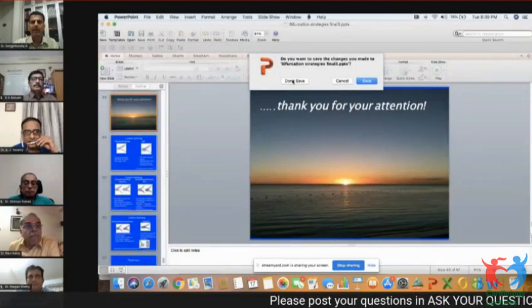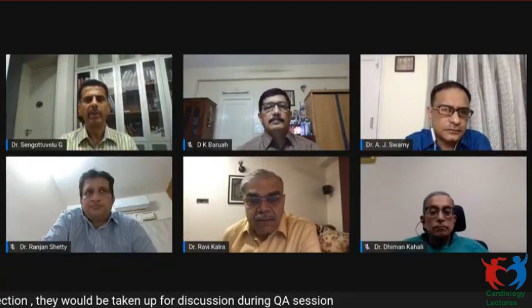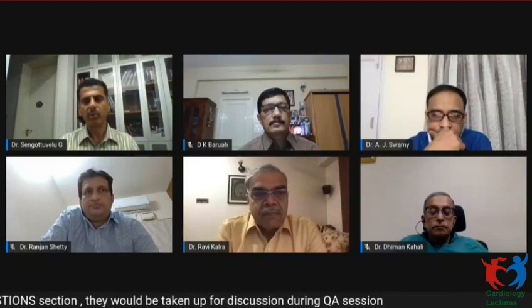Fantastic. I think the important point for any beginner is to assess the anatomy very carefully and at least know the three simple techniques: the provisional, the T-tap, the culotte, and if needed, DK crush. DK crush, as Dr. Ajay said, needs more experience. You can start with these two techniques, T-tap and culotte, if you want two-stent techniques. And in the majority, provisional is going to be the easiest and the best for the patient. So let us start a quick discussion.